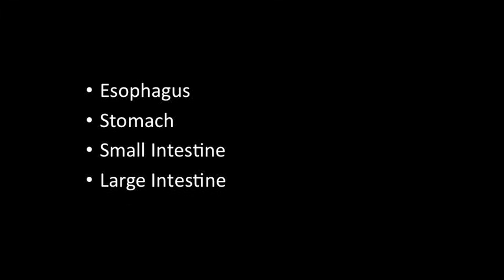This movie presents an investigation of the structure and function of the gastrointestinal system using endoscopic videos and histological samples. The distinct structures of the esophagus, stomach, small intestine, and large intestine will be investigated at the anatomical and cellular level, providing a comprehensive overview of this complex system.